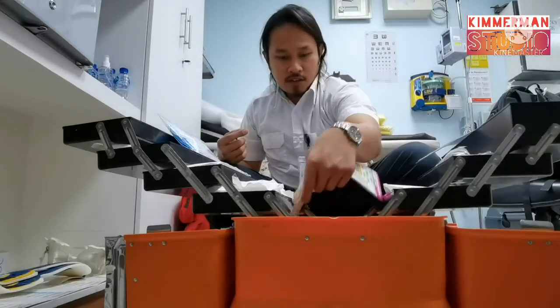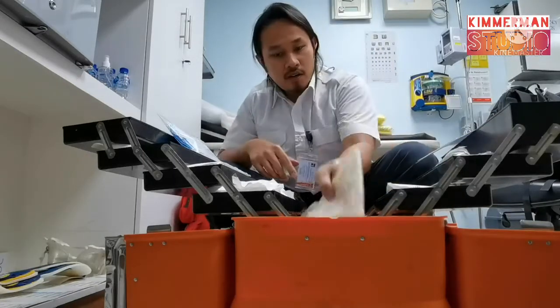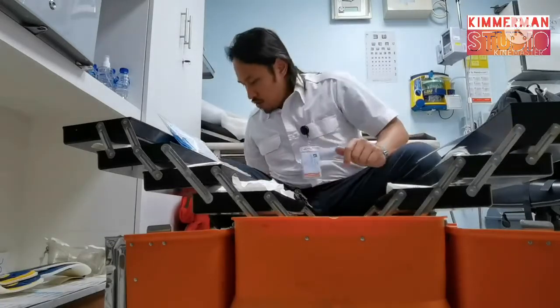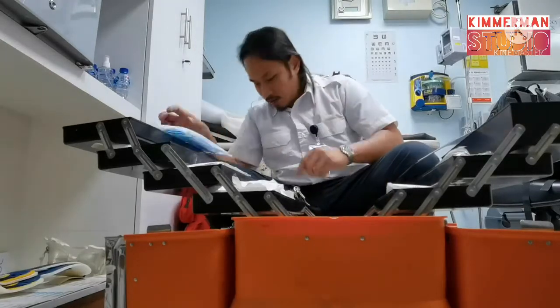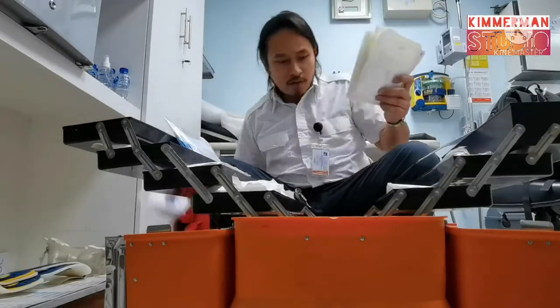You need to check this from time to time so that you will be familiar with the items inside. And in case of emergency, you know what to get inside. You know where the things are located. I know you agree.